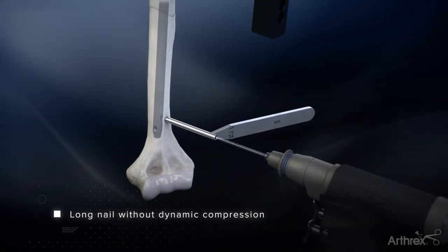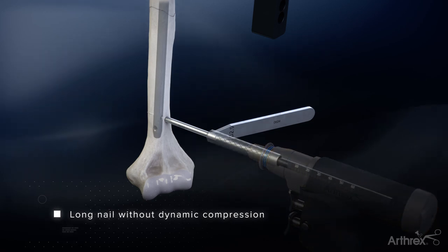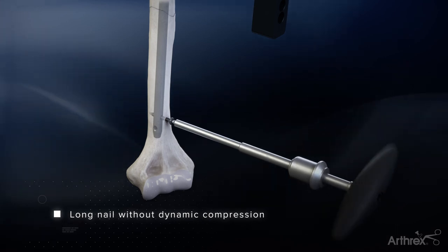For distal screw fixation, drill bicortically utilizing the 2.9mm drill sleeve and drill bit. Once the screw length is determined, use the 2.5mm hex driver and T-handle to insert the 3.5mm screw.